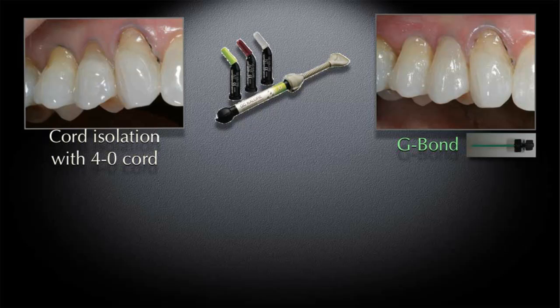It's very thin, and so when I pack this, I'm not going to be breaking any blood vessels. This is very important, because once you start breaking capillary blood vessels, you're going to start to have bleeding and contamination, and it's certainly going to become a problem as you are trying to restore it. So I always try to be very light-handed in placing these cords, and you'd be surprised how very, very minimally invasive you can be in actually restoring these teeth.